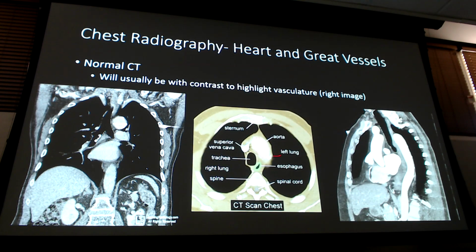There's different slices, different areas, right? If I expect you to pull out an anatomy piece on a slice of a CT, it will be one that is clear enough and not ambiguous like this middle one, right? Because if I were to scroll up and down, then I might be able to trace something and figure out what body part is what. But if I'm going to give you one, it's going to be one that we cover specifically. I will point out specifically and say, this is this, this is that.